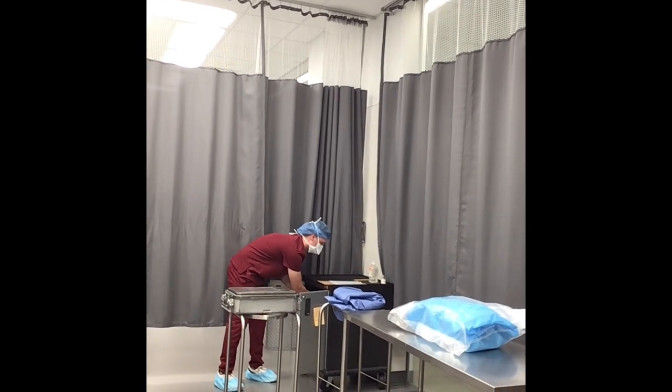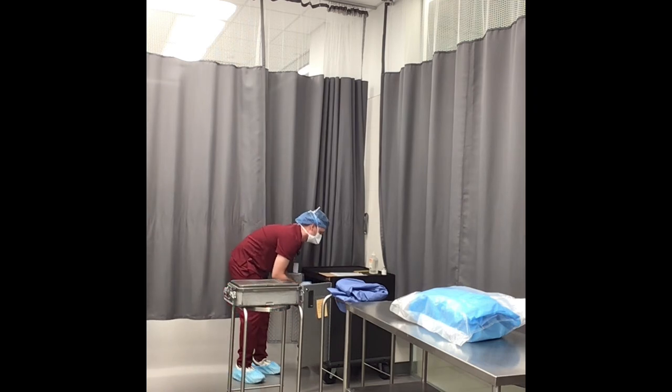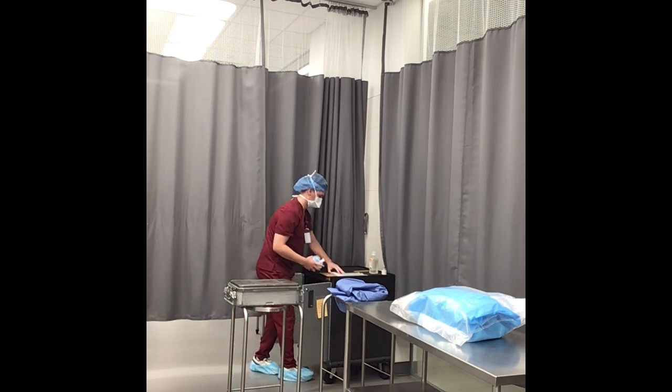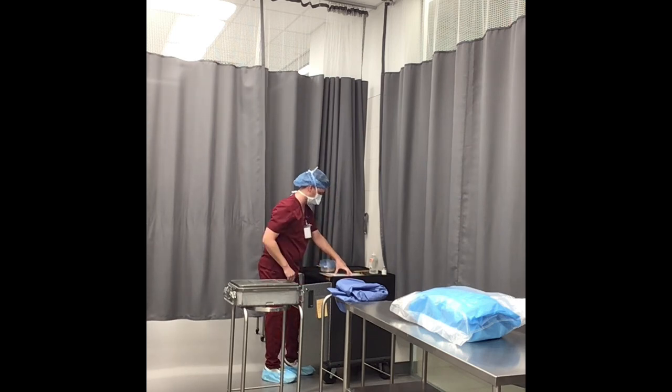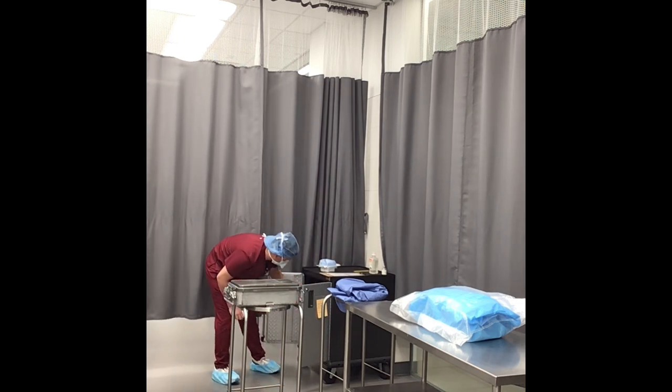Okay. I pack a laps, I pack a Raytex, and again, I'm just reading through this. I'm going to try and be as efficient as possible and kind of look through this whole thing to make as least amount of trips as I possibly can.